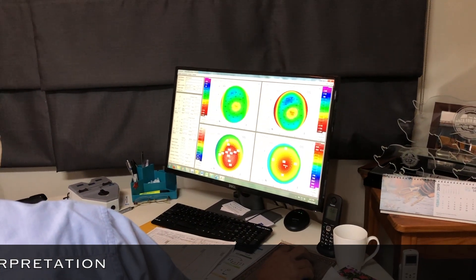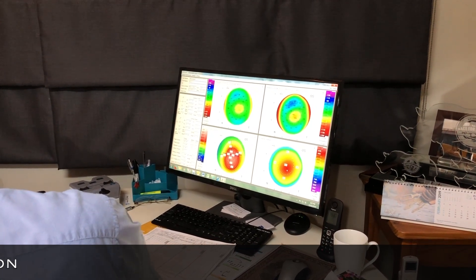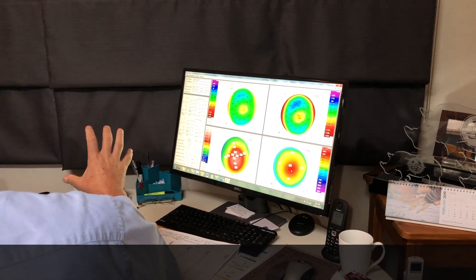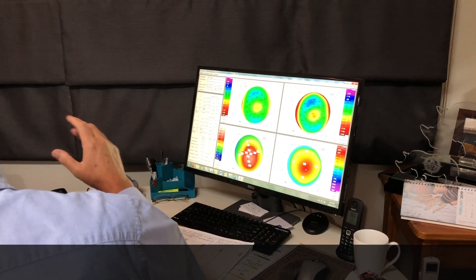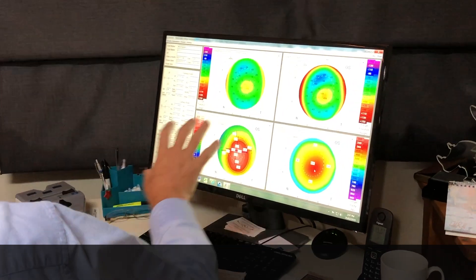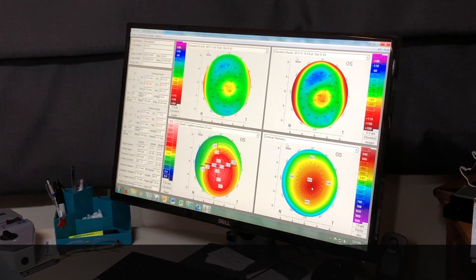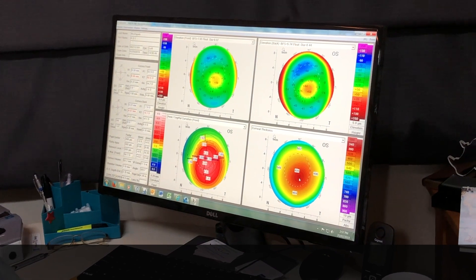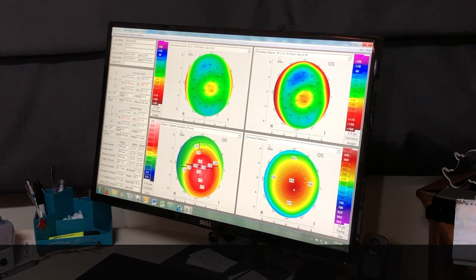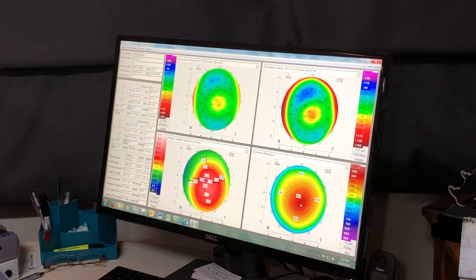Now if you look at the thickness map, the thinnest part of your cornea is 383 microns. This is a condition called keratoconus. It's a condition that starts in your teenage years normally and it's slowly progressive. So it's very important to check this test over a period of months just to see if there's any progression, because we've got tools now that we can use to stop it from getting worse.